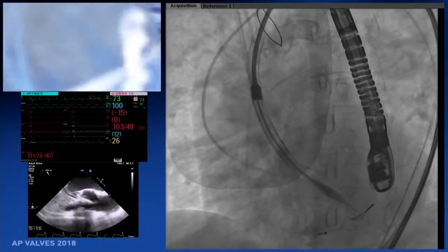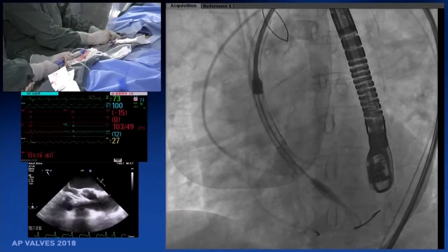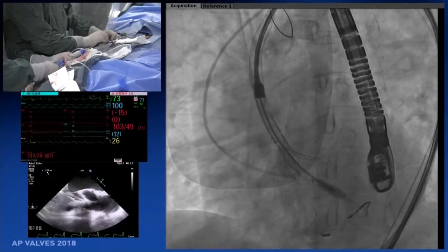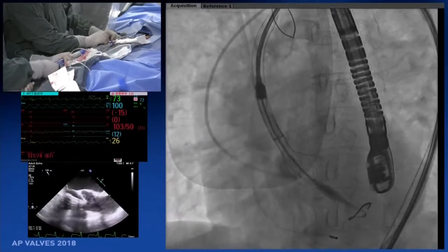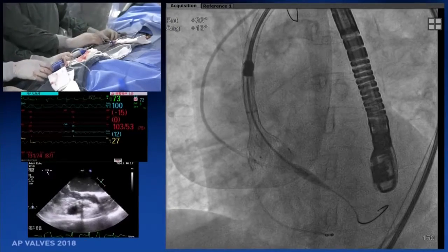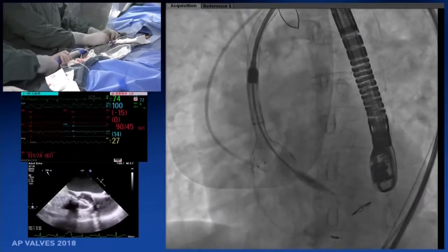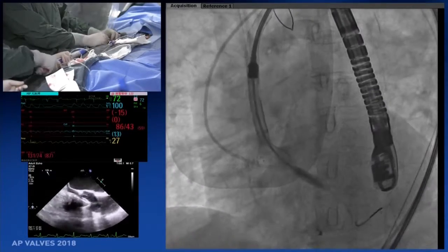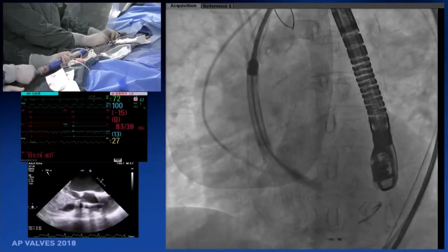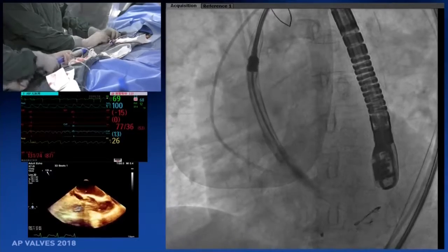Yeah. Do you know that because of the bicuspid, if the initial deployment is too low, you're already diving. Mm-hmm. Because of squeezing, it will be diving. So the control is not so easy. Oops. It is very difficult because there is not only... Why does it jump out? It's also the septal bulge, which probably causes it. It's both.